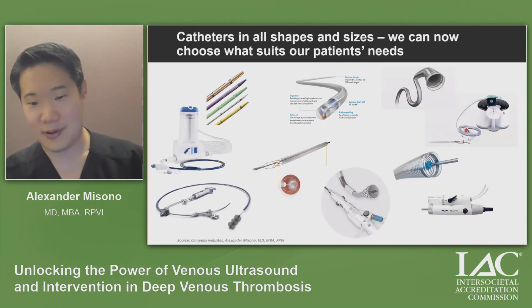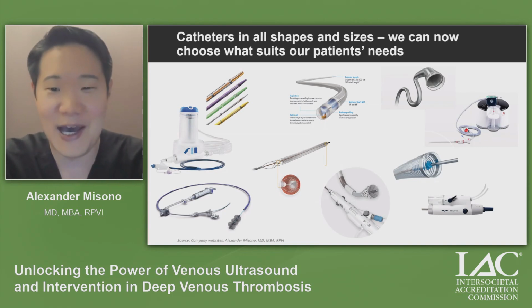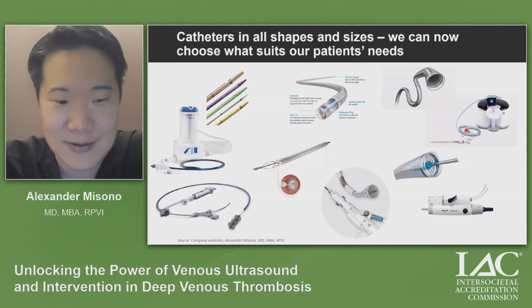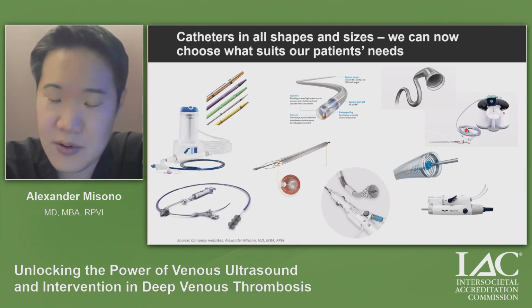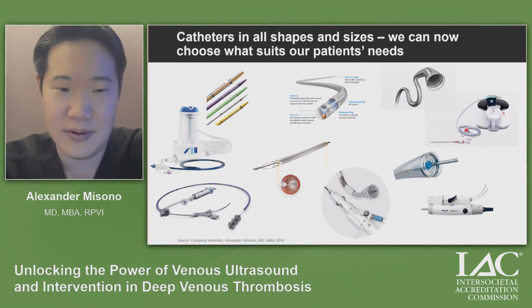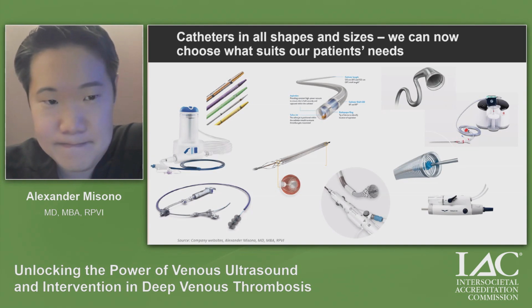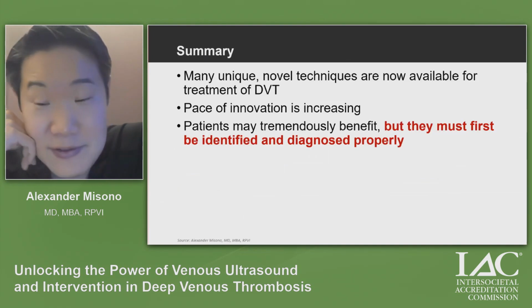So I will not bore you with all the ins and outs of all these different catheters. There are a lot of different cool looking, exciting looking catheters on the market, all shapes, colors, sizes, catheters with things inside of them, things that spin, catheters that remove clot off the walls in an atraumatic fashion. What a great time to live, that doctors are able to access all these technologies to suit your patient's needs. So in summary, we have a lot of novel technologies available, novel techniques.